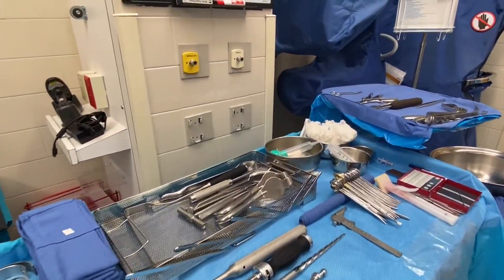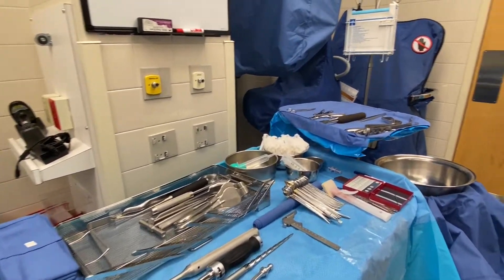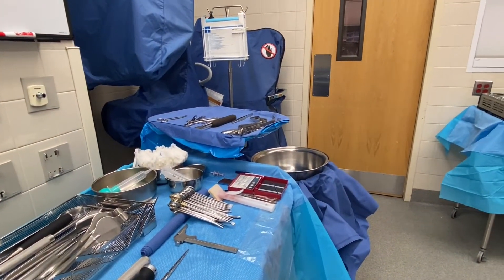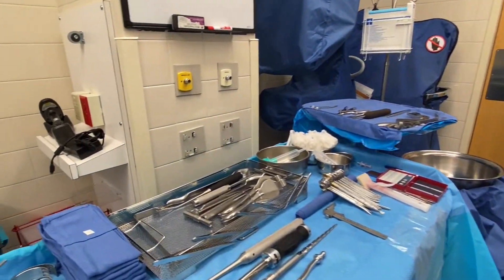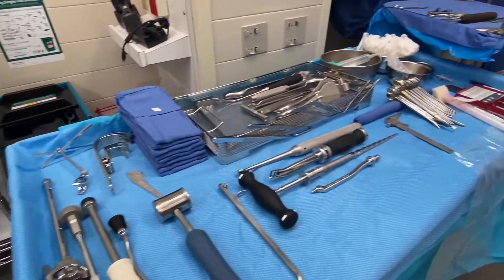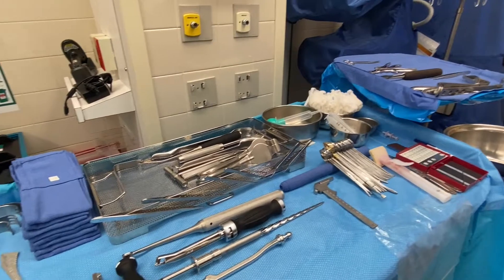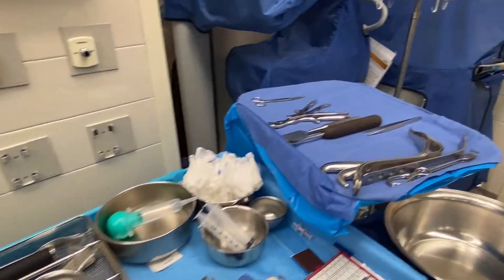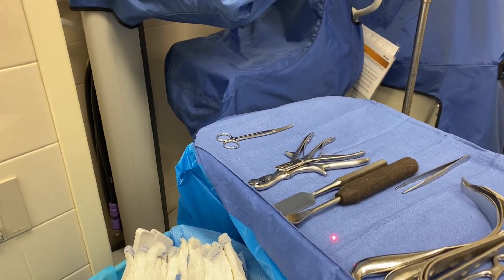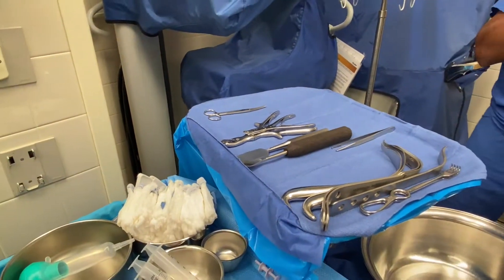As far as I understand, we usually go in to the hip and then we dissect, we get down to the femoral head. Once we get to the femoral head, we take a saw and we cut. After you use the saw, you usually use the osteotome to remove the head, correct?